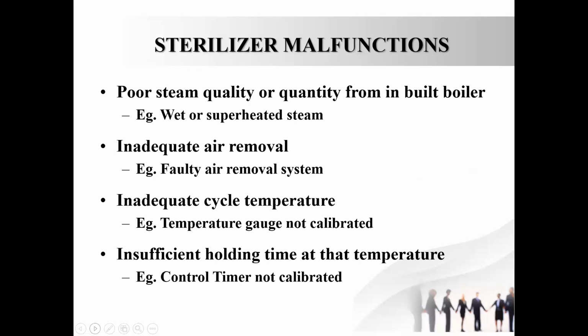Sterilizer malfunctions will normally be checked by your sterilizer manufacturer; this is just for your general knowledge. First, poor steam quantity or quality from the inbuilt boiler. Second, inadequate air removal, that means the vacuum is not created properly. Third point, inadequate cycle temperature; your sterilizer is not reaching the correct temperature. Fourth one is insufficient holding time at that temperature, where the control timer is not calibrated, so the holding time is less.